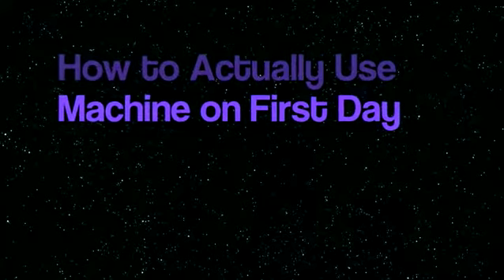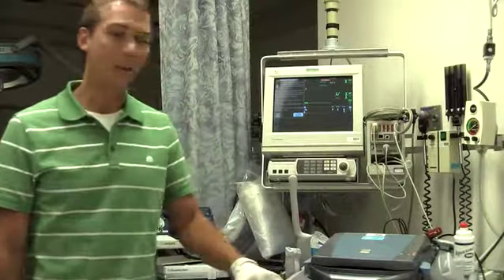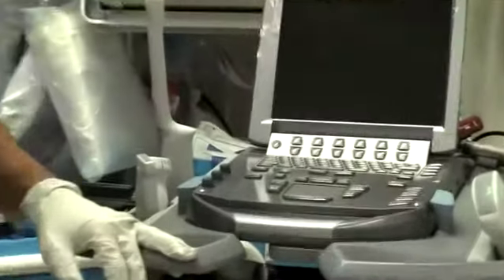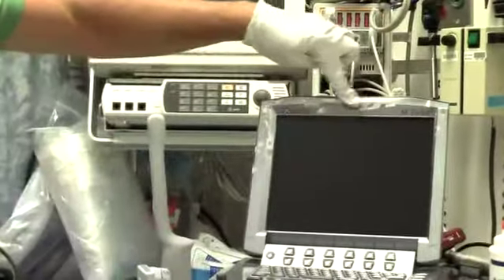Hey everybody, I'm Brent Becker. I'm the Ultrasound Fellow for this year, 2010-2011. I'm just going to give you a basic introduction to the machine and the ultrasound rotation in general. So we'll just start with the basic machine. This is the Sonosite Turbo. This is going to be your workhorse machine. Flip the screen up. Try to avoid putting stickers along here because it leaves all this nasty residue.